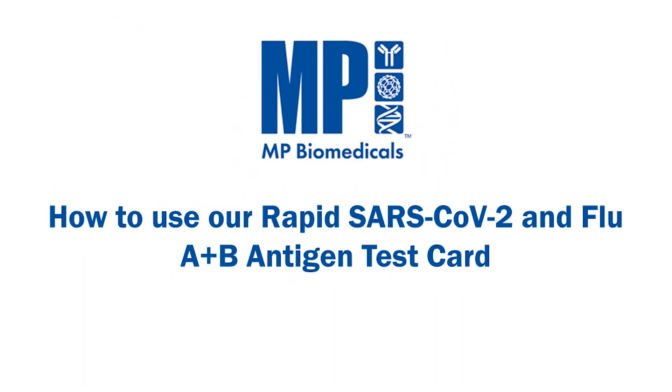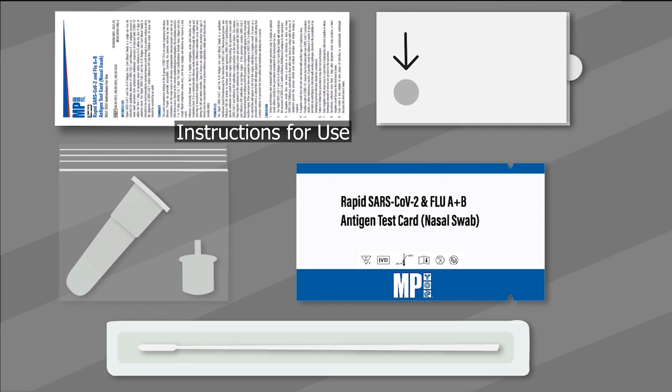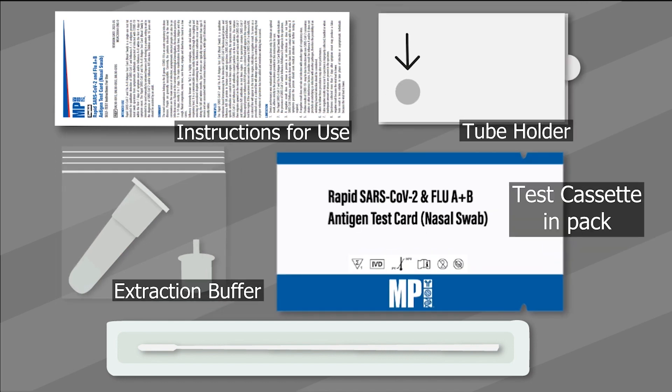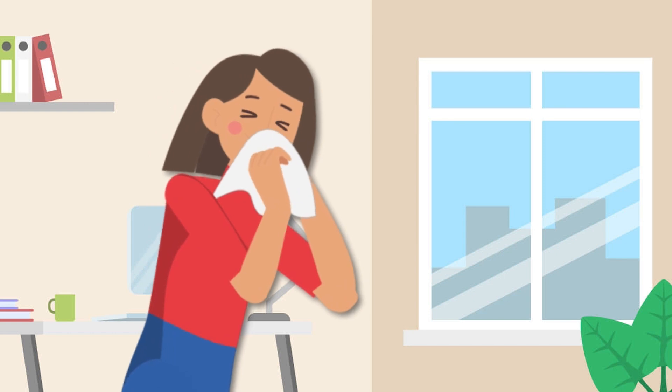Wondering how to use the test? Here are some easy steps. Open the box and get all the products out to check the kit contents and make sure that nothing is damaged. Now blow your nose and wash your hands.